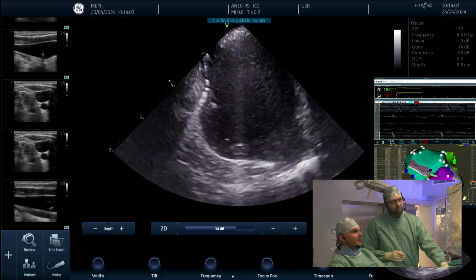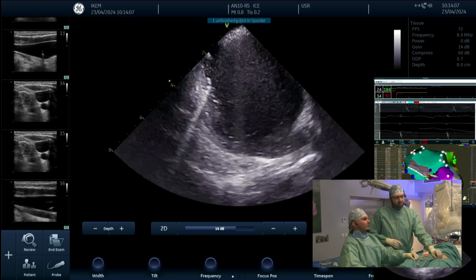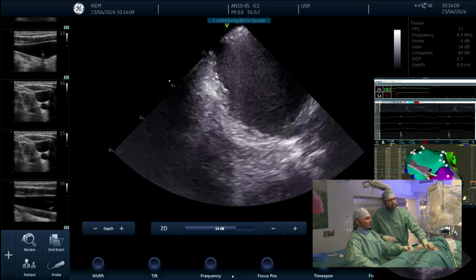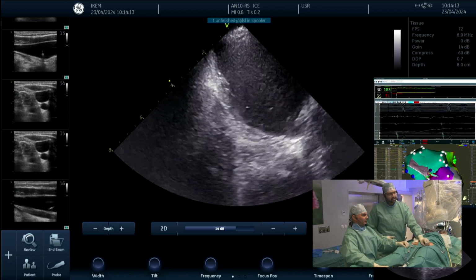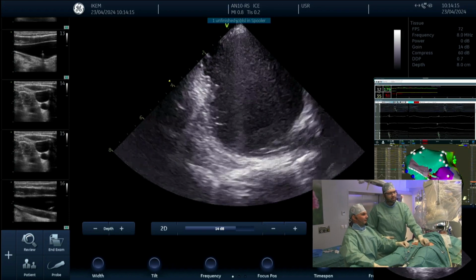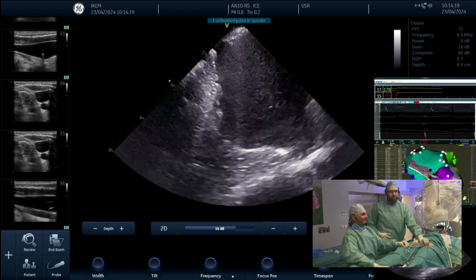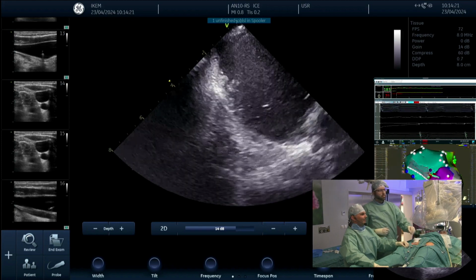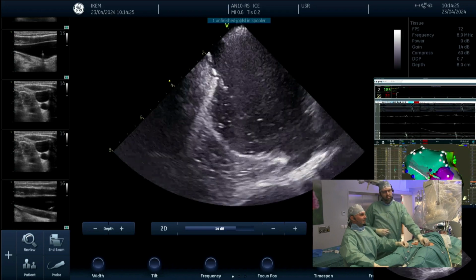So everybody understands now the concept, because sometimes people mix up extra cardiac vagal stimulation with stimulation on site, you know. So this is a completely different thing. And we also tried, we bought in the past this segmental gamma camera. We tried to display with MIBG, it's completely non-reproducible.